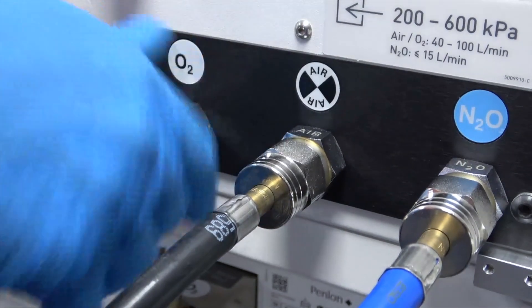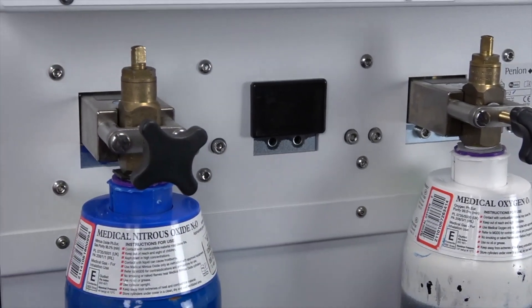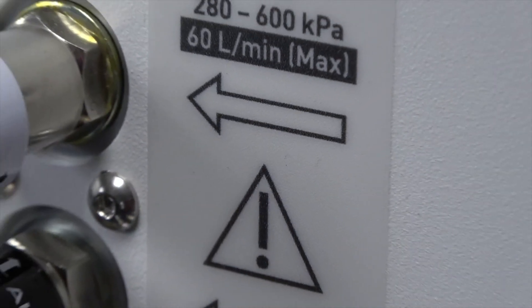Pipeline gas inlets, pin-indexed cylinder yokes, auxiliary gas outlets, and territory-specific auxiliary power supply sockets are all located at the rear of the Prima 460.